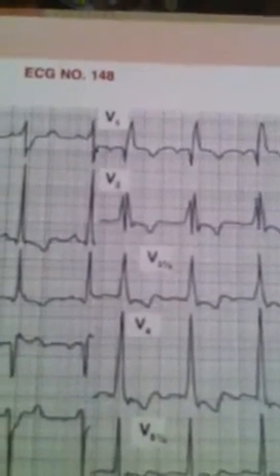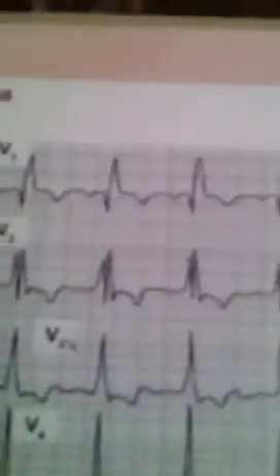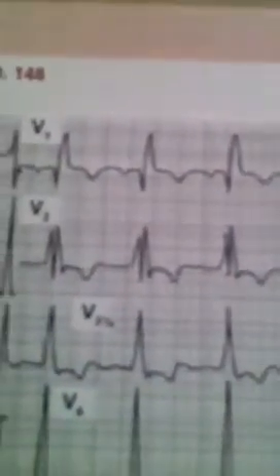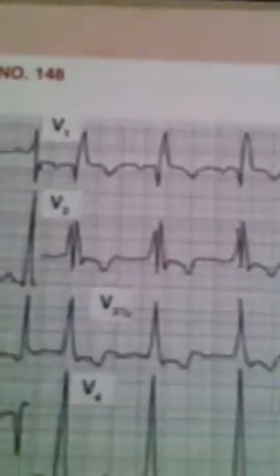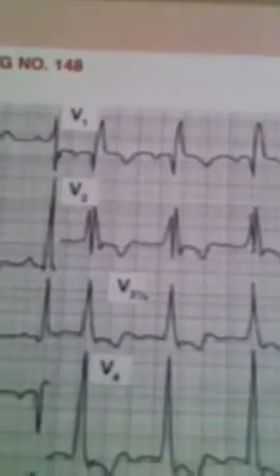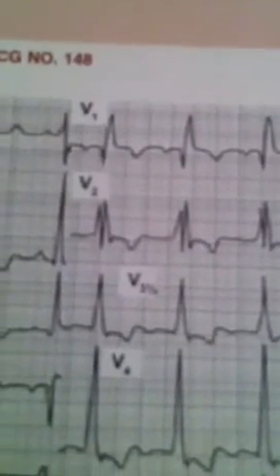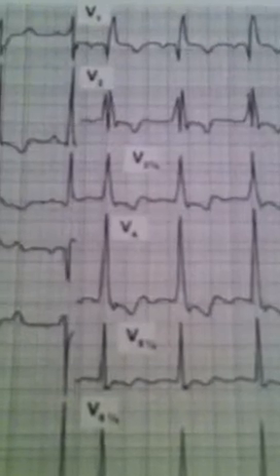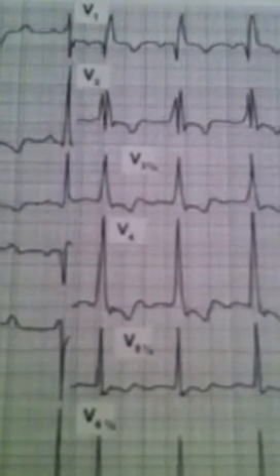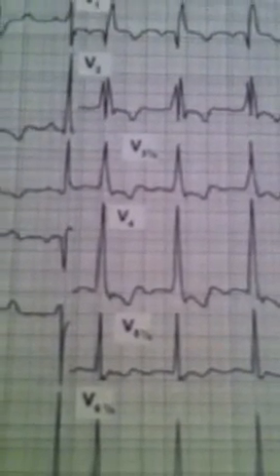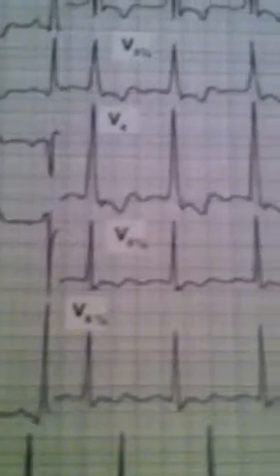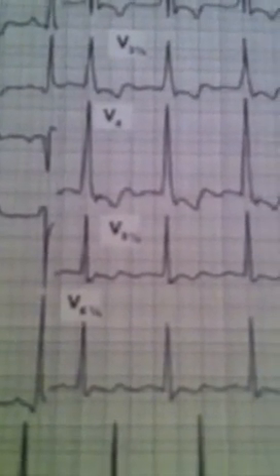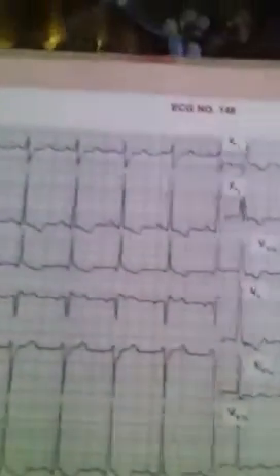However, the presence of an initial Q in V1 instead of an RS pattern may denote the presence of a big anterior or anteroseptal infarction. Looking at the tall R waves in V4, V5, and V6 — noting this is half voltage in V6 — there is also left ventricular hypertrophy.